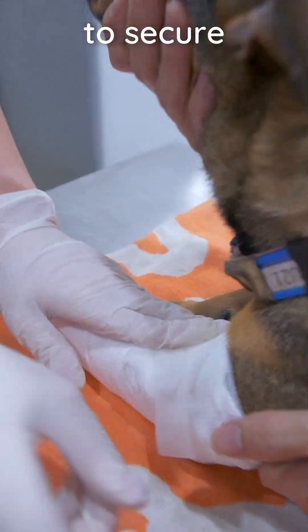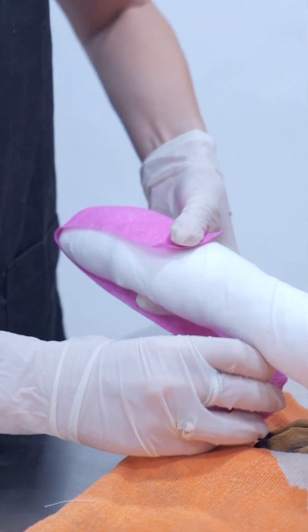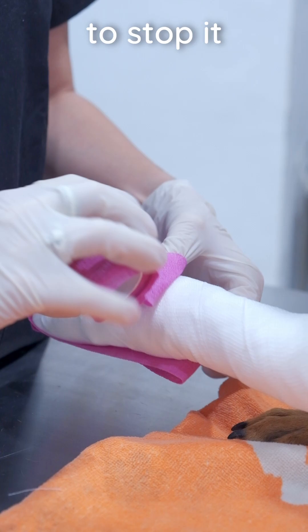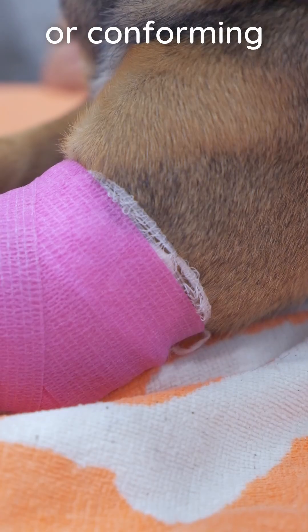Cut the bandage and use tape to secure it in place. Then repeat again with the elasticated bandage. Stretch out the bandage first, then relax it and apply to stop it from becoming too tight. The elasticated bandage should not overrun the padded or conforming bandage.